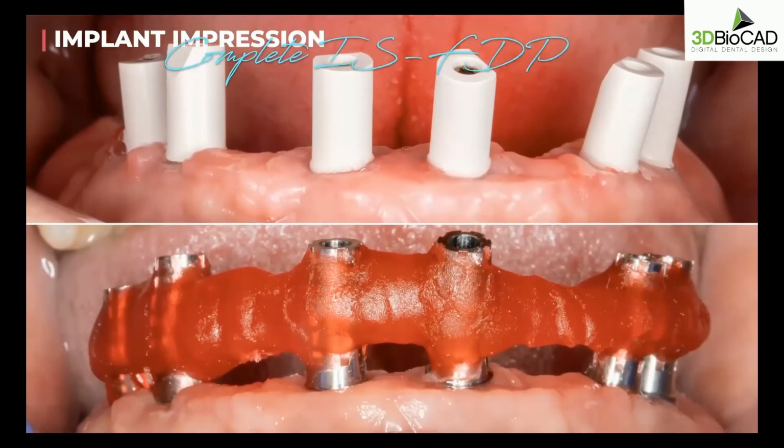However, what I noticed is that with scanning, if I'm using scan bodies and doing the digital scanning of the implants for full arch cases, sometimes it is not 100% accurate. So I definitely want to confirm that the implant position, that the scan, was accurate. So I use a little bit of analog technique where I make a verification jig. Basically, I insert the temporary abutments onto the multi-unit abutments, and then connect them inside the mouth. Now the lab will be able to use this to see if the implant scan was accurate.